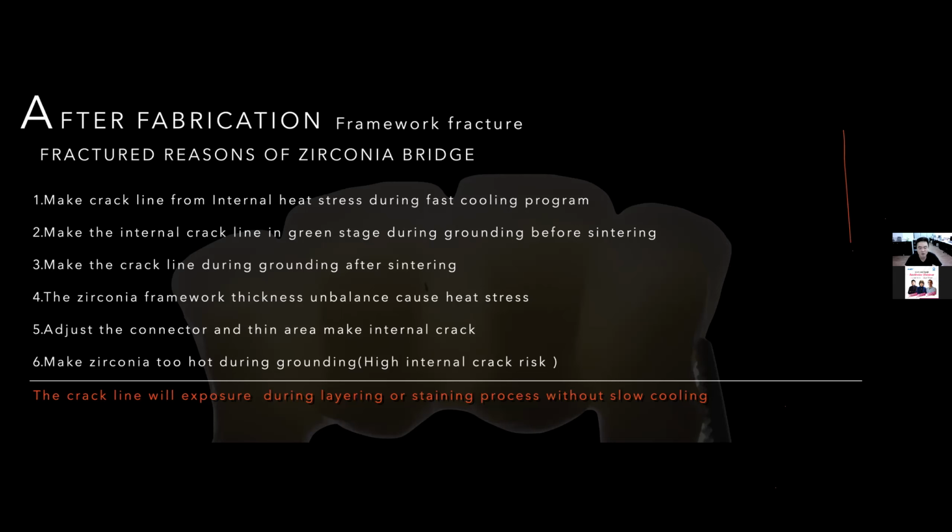Even just 1 gram for the molar or for the very long anterior, that is a very big volume. If you don't use a slow cooling, your framework cooling is not very balanced. That will leave stress inside, and that will make your framework have a crack line. So this is a danger.